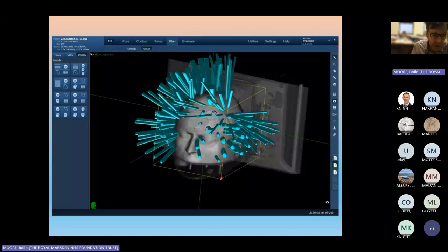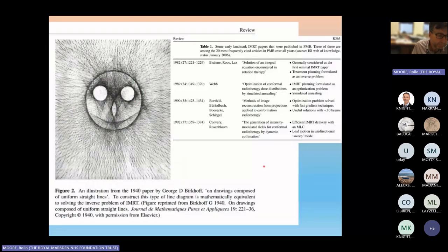And this somewhat eye-catching image represents the separate radiotherapy beamlets by hollow tubes, sort of aiming within the patient brain and showing the different entry orientations around the patient. There can be hundreds of beams. There's probably about 80 here of slightly different diameters. The minimum is 5 millimeters, and I think the maximum in this plan is probably 20 millimeters. But it's showing the range of entry angles and positions. That is a phantom plan. That is to say, it's not a real patient.